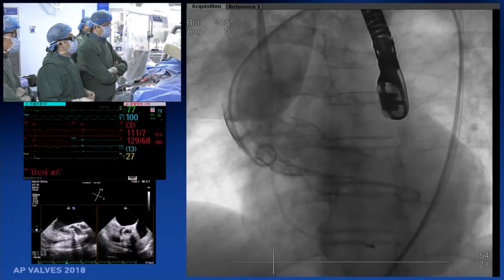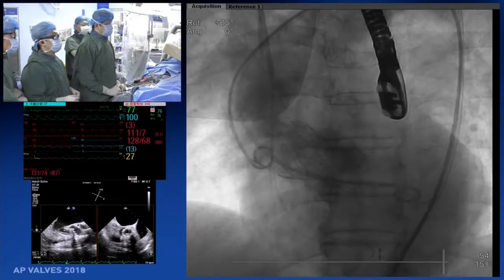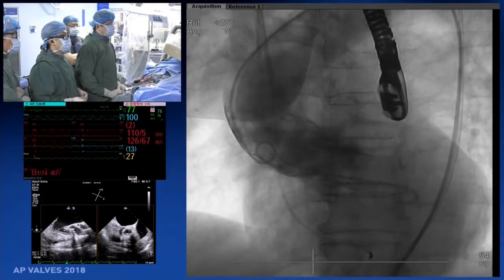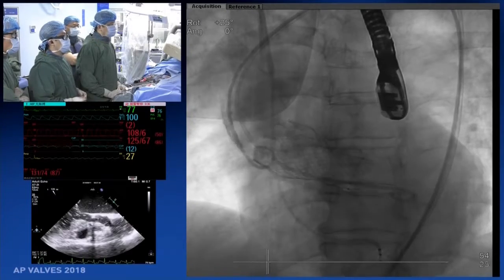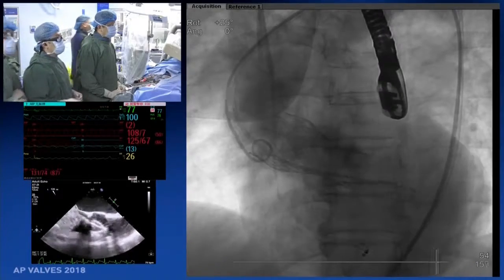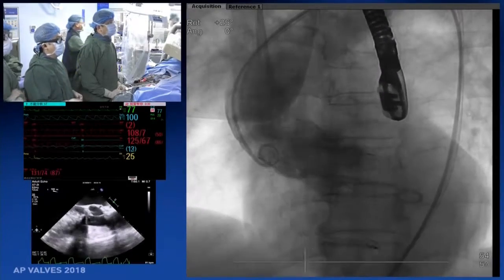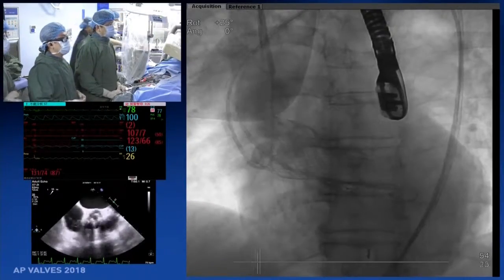Yep, I agree. Tough case, and I would call it an end. Reverse the heparin and make sure the patient is going to be safe. There's not much you can do now. Even if you do, what do you want to do? Post dilate again? I don't think it's going to change that. And given the stronger expansion force, it might actually even get better over time.